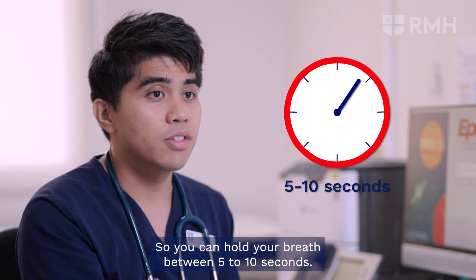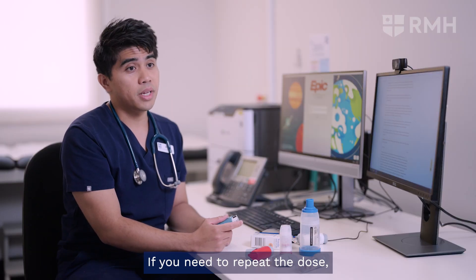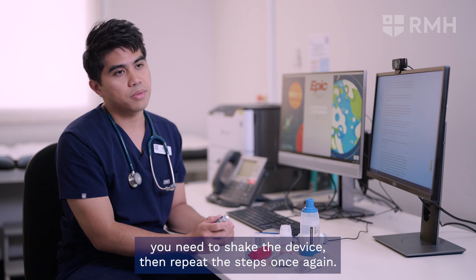Hold your breath for five to ten seconds. If you need to repeat the dose, shake your device and repeat the steps once again.